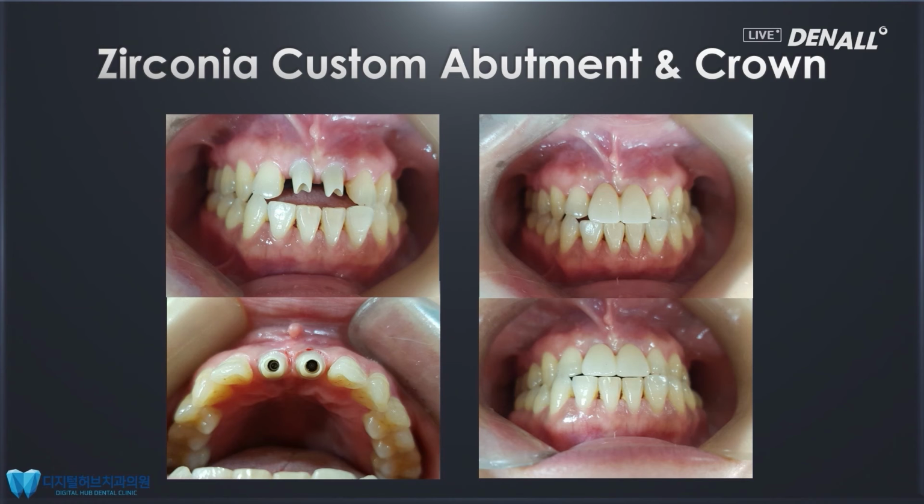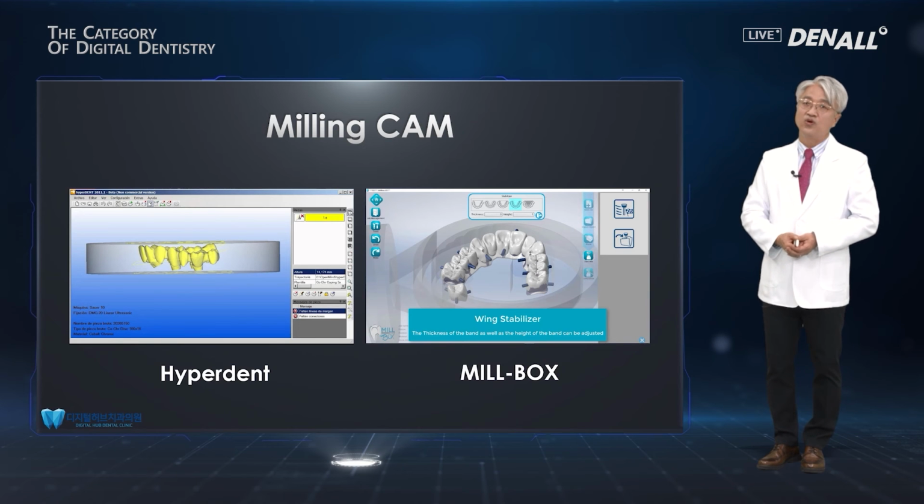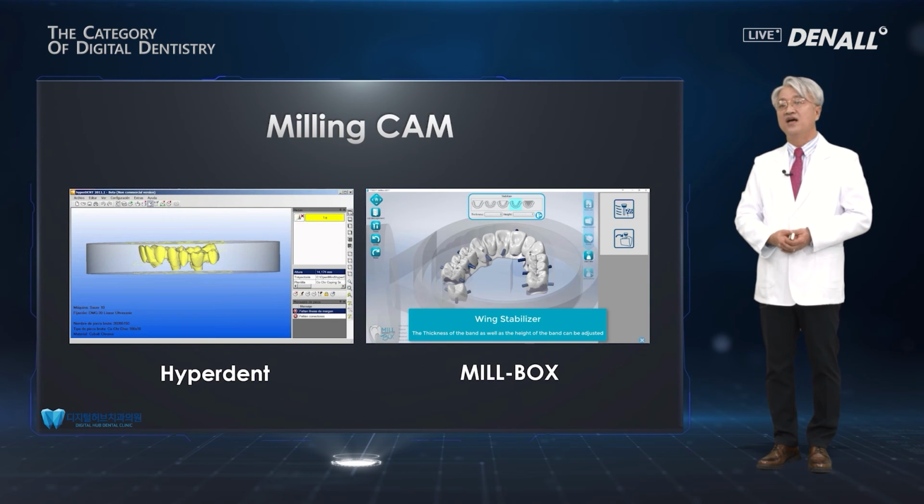Next, on the anterior implant side, a metal or titanium abutment is used. Then the color, aesthetically, is not that pleasing. So for the abutment, now using zirconia, a link system or ready-made abutment is used. But a custom abutment here is created with zirconia, and to make it most aesthetic, that approach was used, and it was quite good.